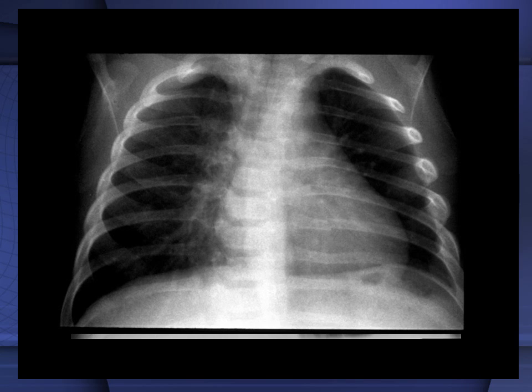It might look like it's a little bit wider than it should be, and that would indicate that something is going on in the patient. But if we look carefully in this area right here, we see a rib fracture. Whenever we see a rib fracture in a young patient, such as a child, we always must include the differential diagnosis of child abuse in our assessment.